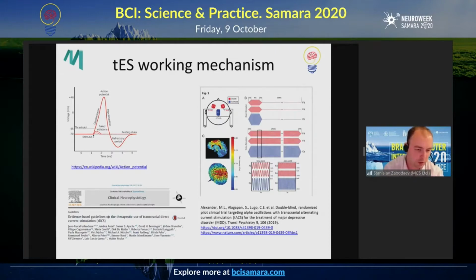When you don't need this, when we only want to excite a part of the brain, you can install the cathode where there's no brain. In most cases, they put it over other areas, on your neck, or even on your shoulder, or even over your mastoid process.